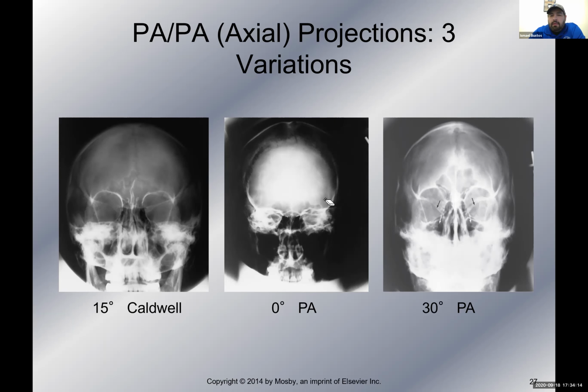How do we get the ridges to fill the orbit here? Well, you need to decrease the angle between the CR and the OML, which means you're either going to have the CR with no angle, or you're going to have an increase in flexion to bring that to a 0 degree angle, okay?